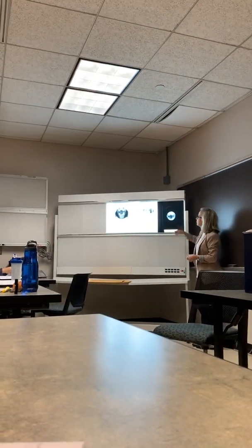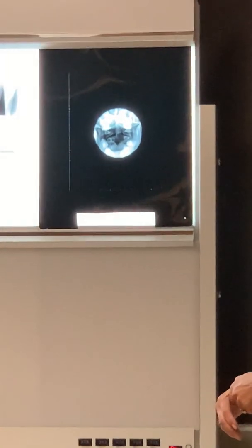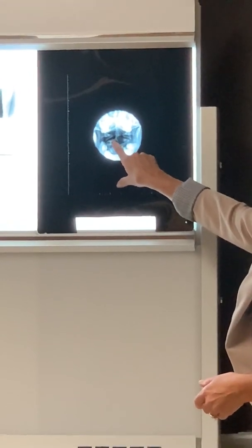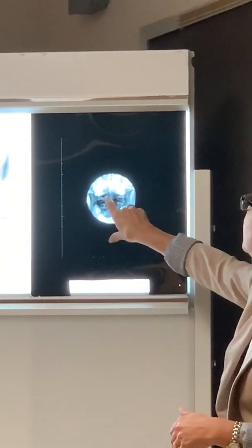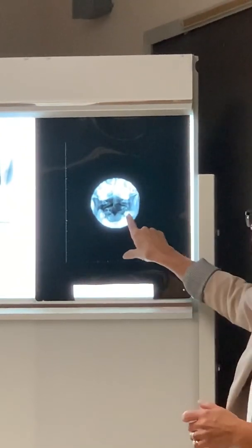All right, so let's look at these three. Let's start here. What do you think about this one? It's pretty tiny, for people to see. Can you see the odontoid process? And like I said in lab, people call these spaces, but it's really the apophyseal joint. The teeth are annoying you a little? It's so close, just a teeny little bit up here. You see a tooth. Otherwise, this one's pretty good. I would not repeat this if I did.